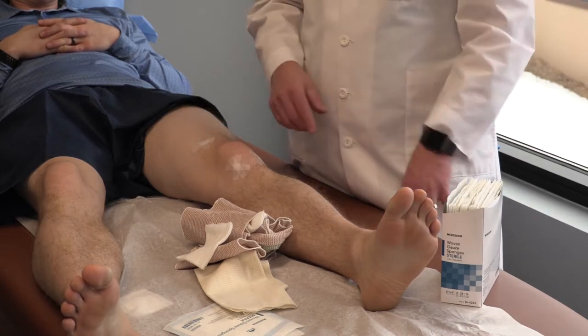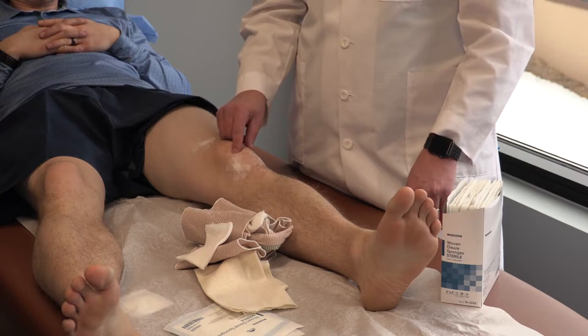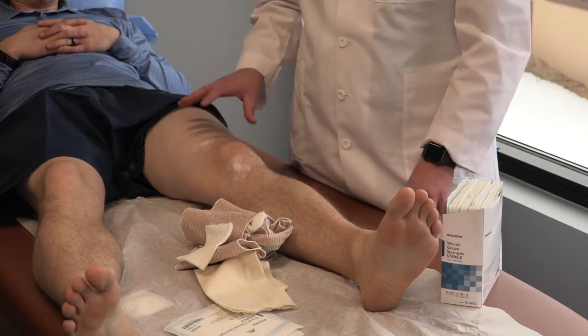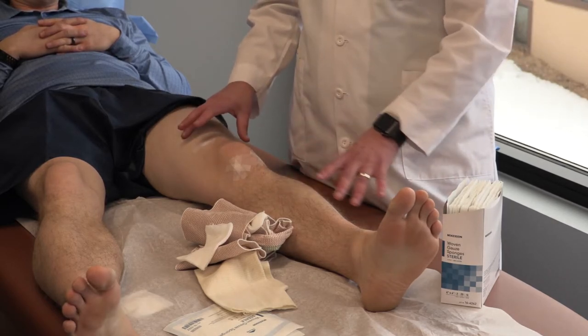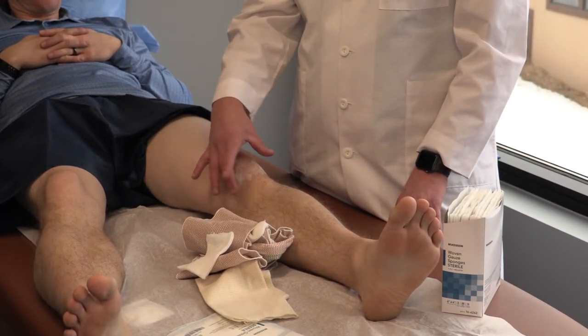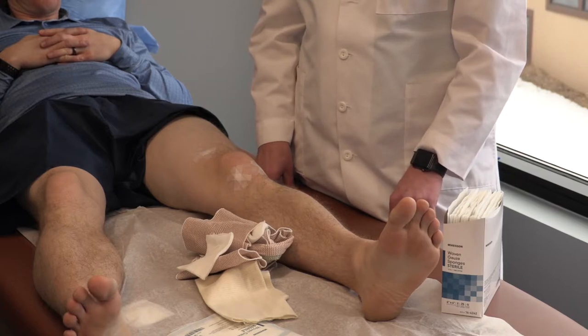Take everything down until you get to the Steri-Strips, and then those you want to leave in place for the first two weeks after surgery. You likely will have some swelling. Sometimes you'll see a little bleeding on the Steri-Strips and sometimes even some bruising around the knee — that can all be normal, and that's nothing to be too concerned about.